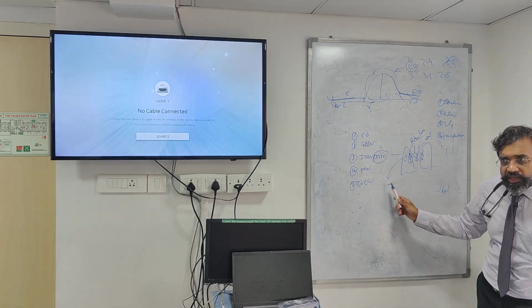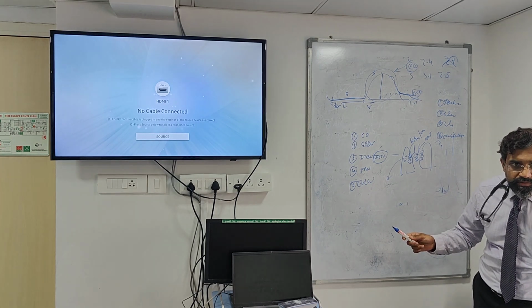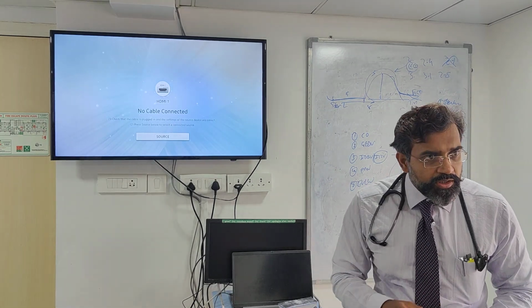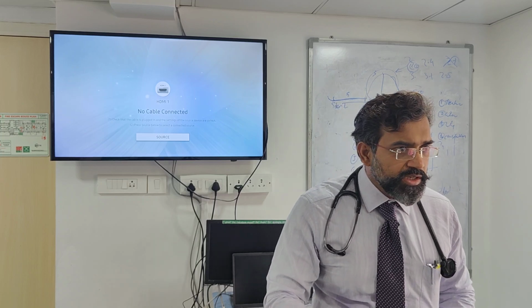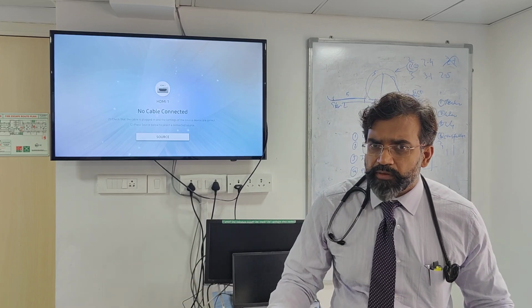Extravascular lung water is the water in the lungs, excluding the vasculature, excluding the heart. Clear on this? Extravascular lung water is probably the best parameter that you can see in this, because no other machine can give you extravascular lung water.